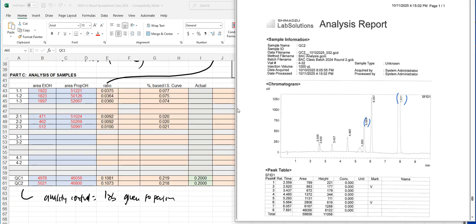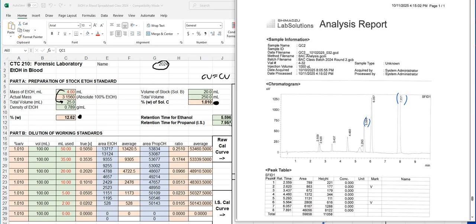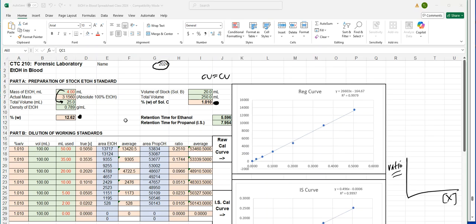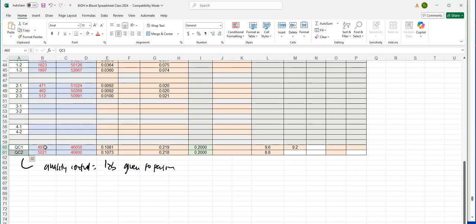So in this particular type of lineup, we're going to go to 5.5 and pull out the area for ethanol. We're going to go to 7.9, and pull out the areas for those as well. These were the values that came from those particular types of reports. Again, this is not going to match your data. Your data set will be your data set. It will be a little different, but it gives you at least a gist of what's going on.